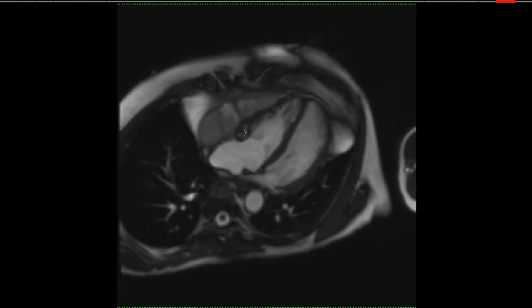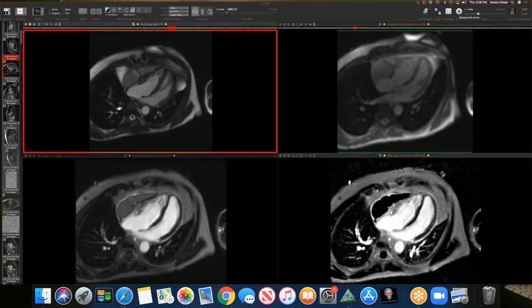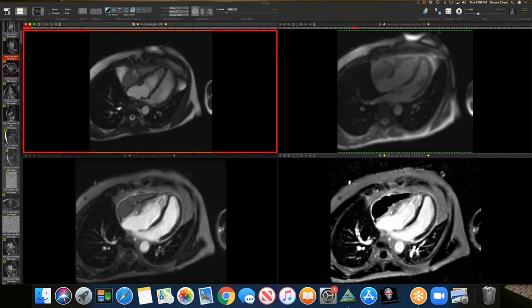It has heterogeneous signal and thick septations. The other thing to notice is the morphology of the ventricles — they're tubular. And then if we play the cine, we can notice some paradoxical septal motion. As the ventricles fill in diastole, there's septal motion towards the left ventricle, and decreased motion of the right ventricle. Septal bounce.